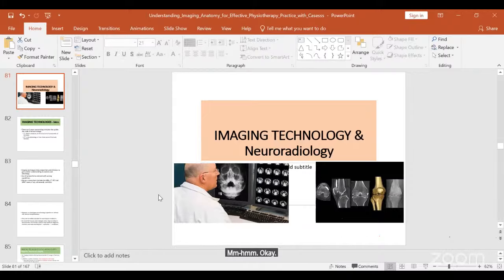Okay, sir. Thank you for the lecture. My question is, what's the best radio diagnostic procedure for diagnosis of bursitis? For bursitis, ultrasound. Ultrasound, cheap, affordable, then MRI. So that was what we gave you as a general guide for fluid-associated pathologies of joints.